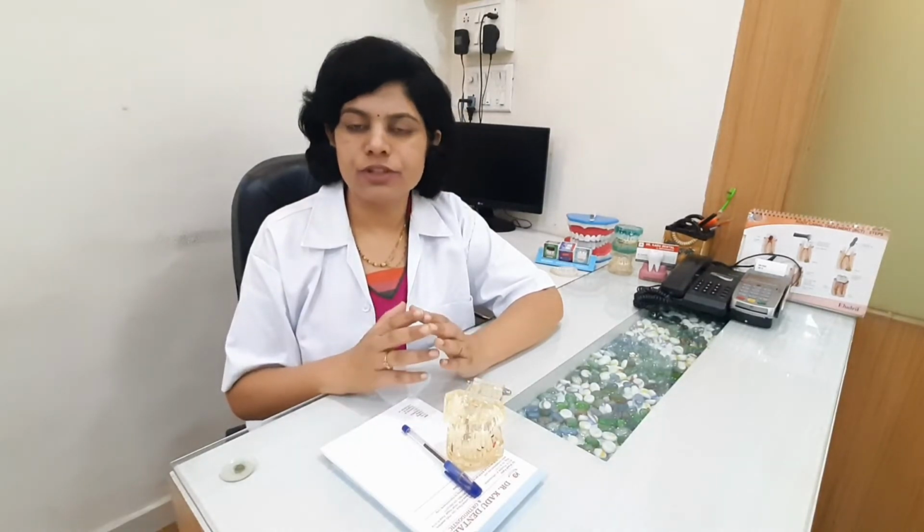In your next appointment, a measurement for the artificial crown will be taken with the help of elastomeric materials. Trial of the crowns is done during the next appointment. Once we are sure that the crown is fitting well, the fitting is good and the accuracy of the crown is good, then we fix the crown in your next appointment.